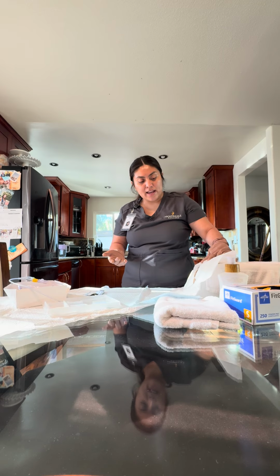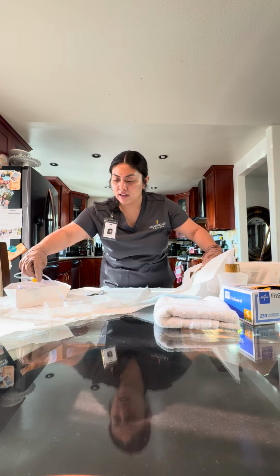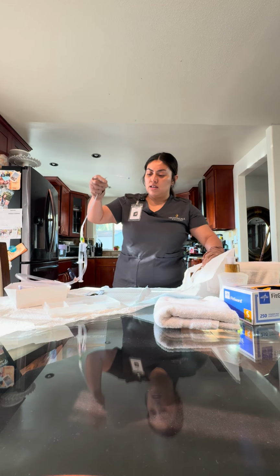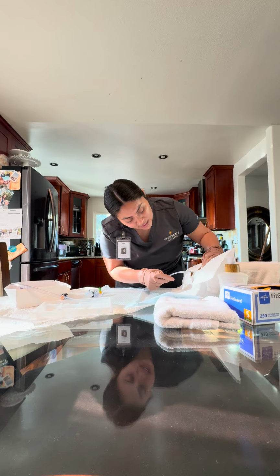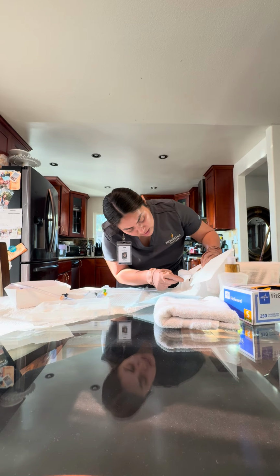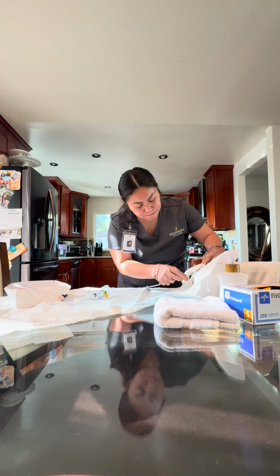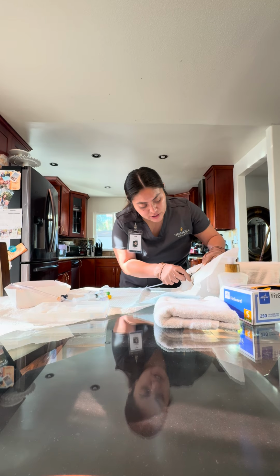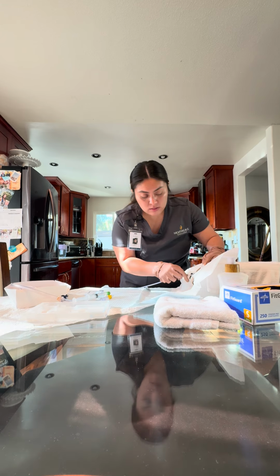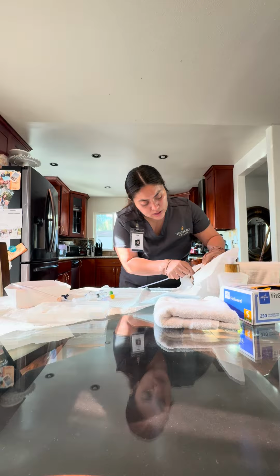So now placing the hand on my patient, I'm going to be grabbing the Foley catheter and placing the catheter inside the urinary meatus. I'm going to be inserting it 3 to 4 inches. After seeing urine expel, I'm going to be inserting it another 1 to 2 inches.